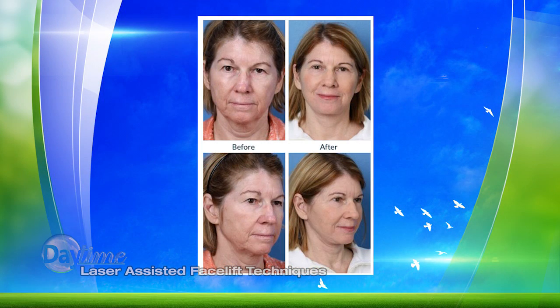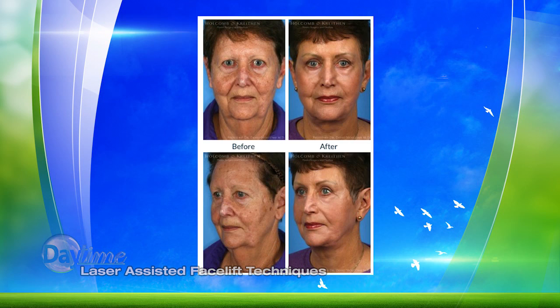Thank you. Glad to be here. So you use lasers with your lifts, right? Yes. Depending on patient goals, we may use a fiber laser, which is a special laser that melts fat underneath the skin to help us contour the neck and the lower face. And then if they also have some wrinkles or sun damage, we may use a laser externally on the outside part of the skin to help tighten the skin and tone the skin.